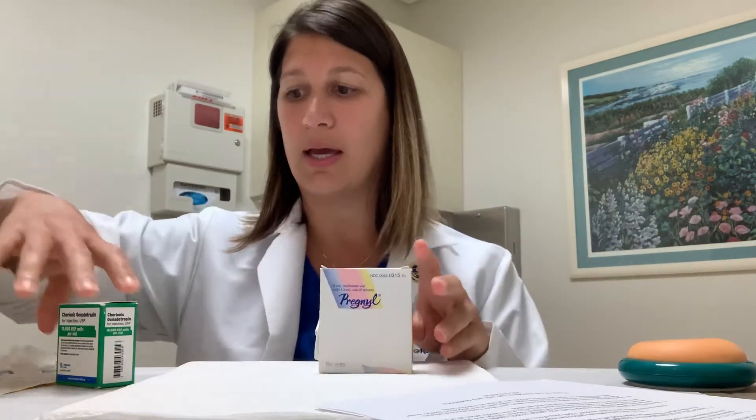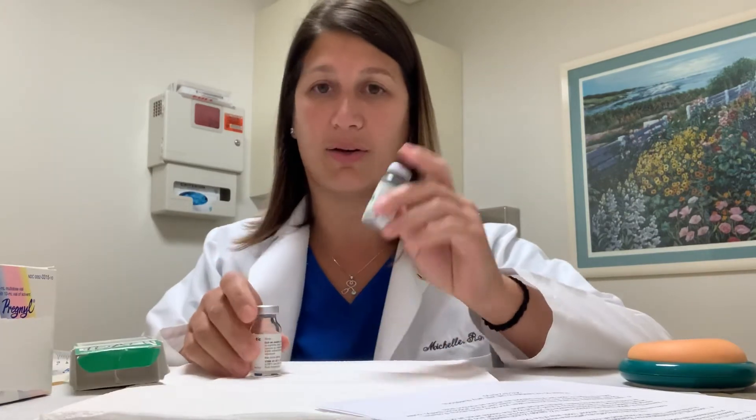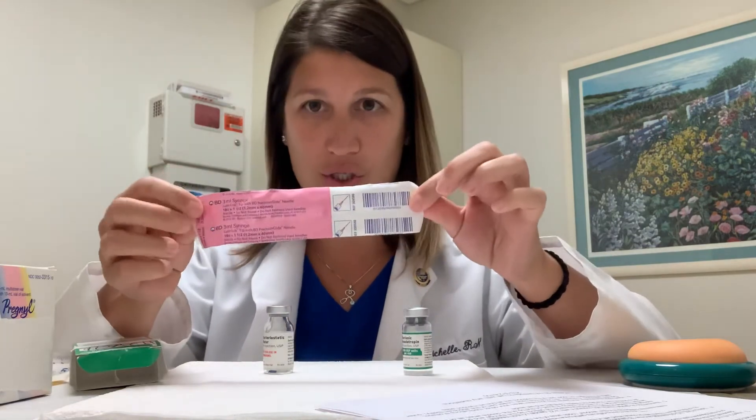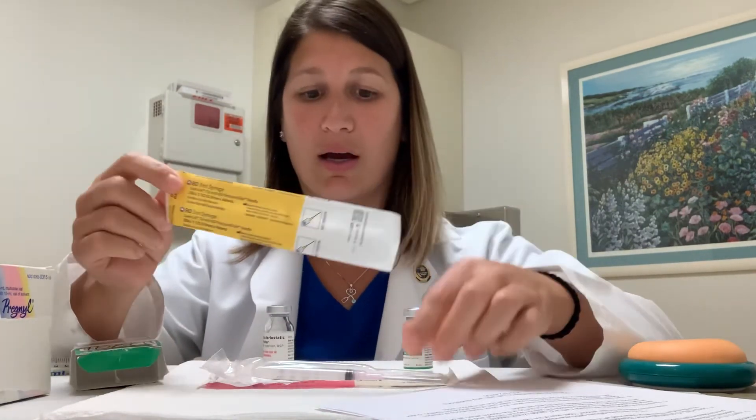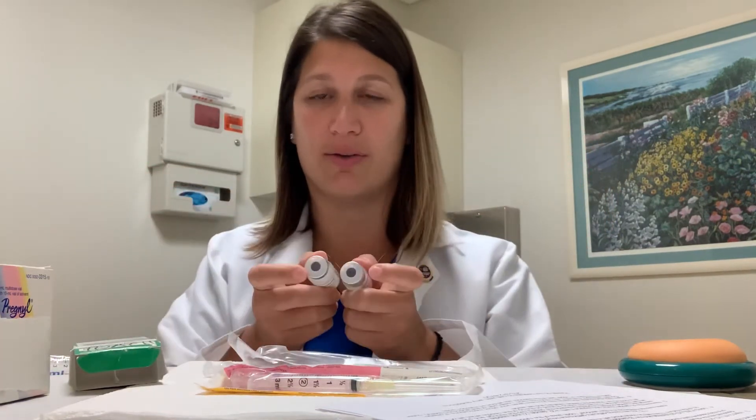If you happen to have the HCG 10,000 unit trigger shot, it comes in either of those two boxes. When you open it, it has two vials — just like the Menopur, there's a vial with powder labeled chorionic gonadotropin and a vial with fluid. There are 10 cc's of fluid, and depending on your dose we'll tell you how much to draw out. You'll have a syringe in either a pink or yellow wrapper — an 18 gauge or 20 gauge needle — but this large needle is only used for drawing up the medicine and is not going into your body. It's just for mixing because the tops don't match and you can't use a Q-cap.